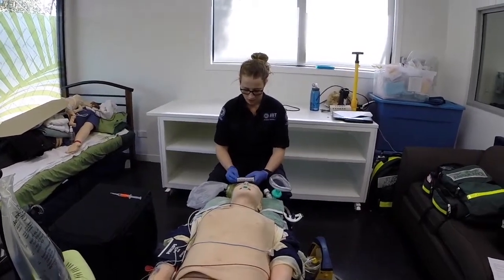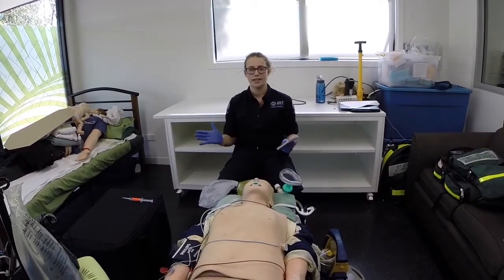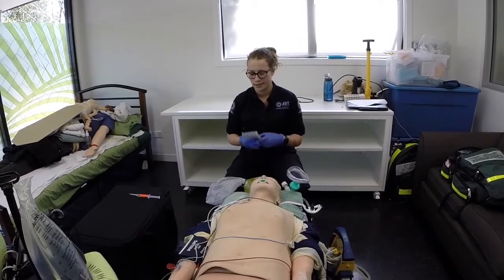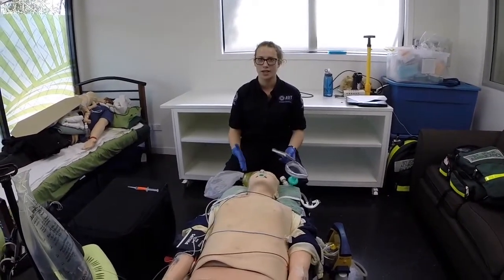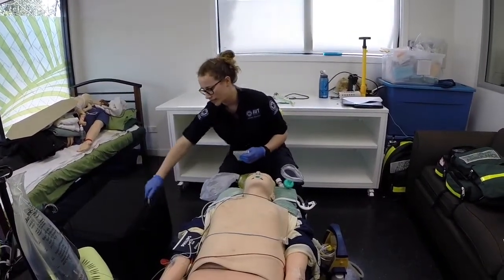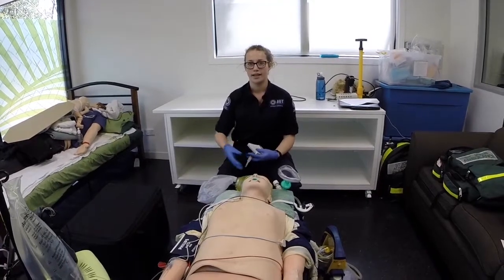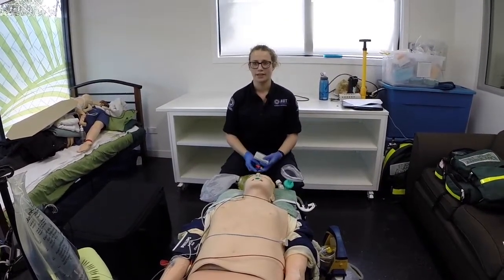And prepare the area. Okay, so we've got to prepare the area. We need to get off anything that we don't need at this moment. So that's any rubbish, any gear that we're not going to use during this RSI procedure. I can get my offsider to do those things for me. And we've got this space here to the right of me for the RSI roll and everything.